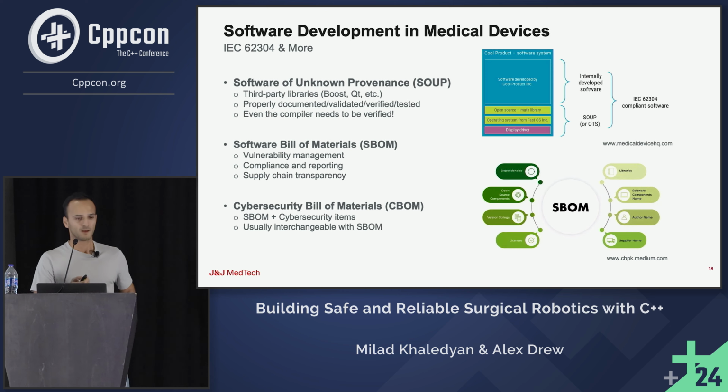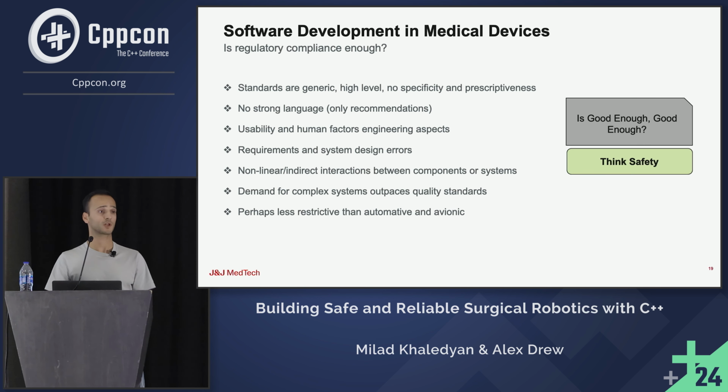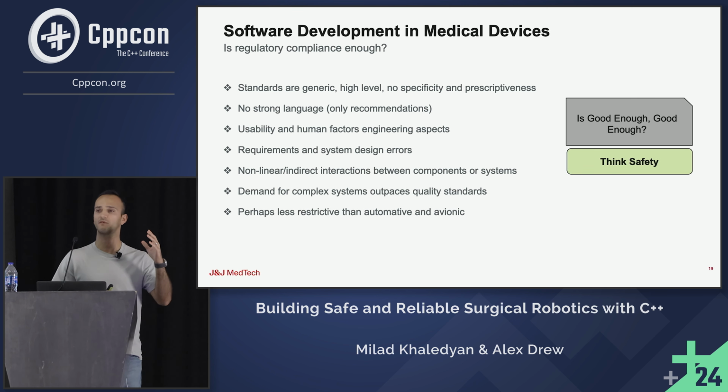Perfect. So we talked about all these standards, we talked about all the regulatory stuff, but is it really sufficient when we have software as medical devices? Is it sufficient that we essentially just stick with the guidelines and ship a product? We have millions of software recalls, medical device recalls, medical device failures.